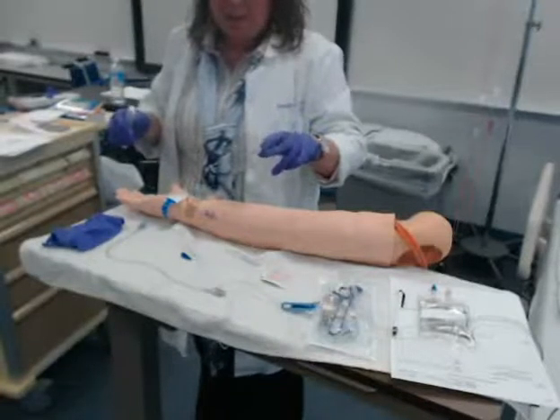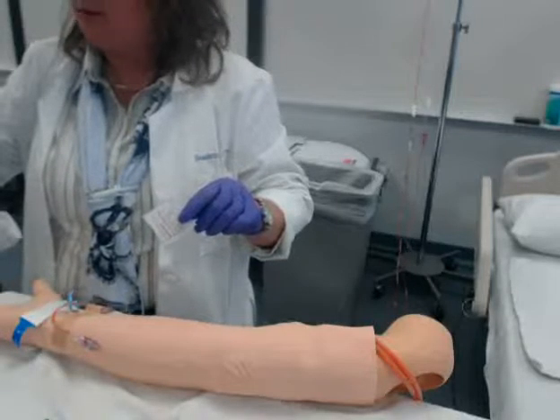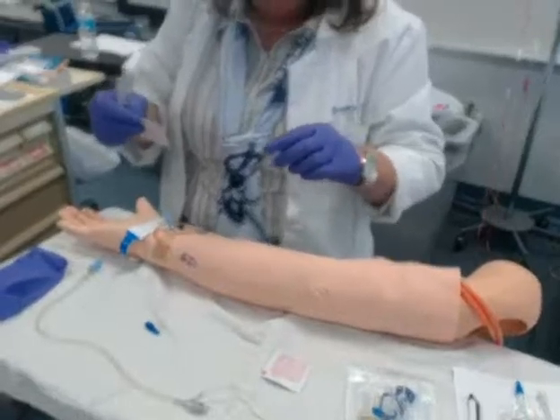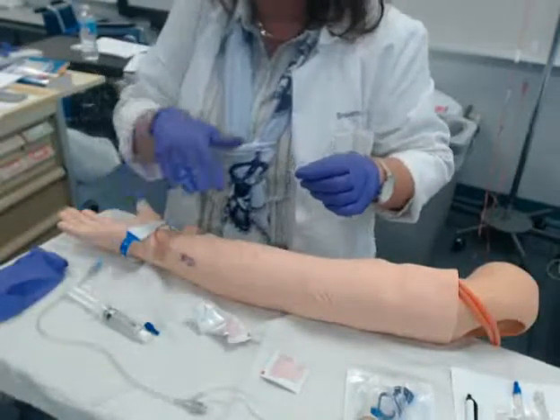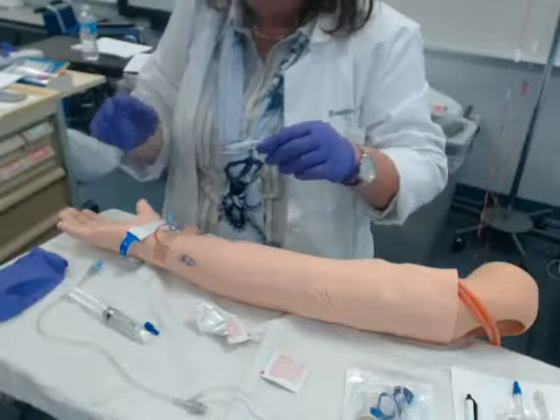I could go ahead and connect this to my patient or connect my primary. In the real world I probably would connect it to my patient, so I probably should do that. I'm going to lay this here, keeping it clean and secure. I have my saline flush and I have my alcohol in my pocket.